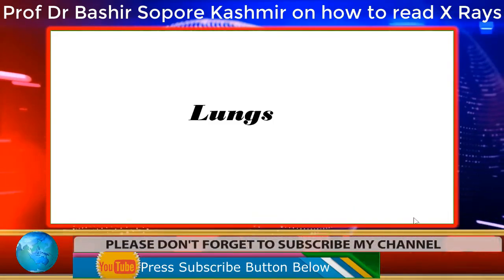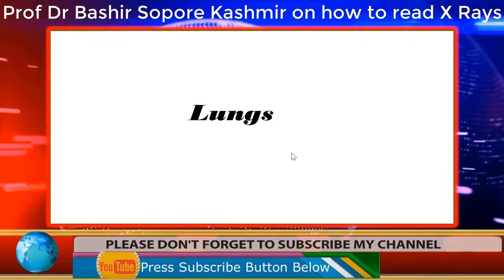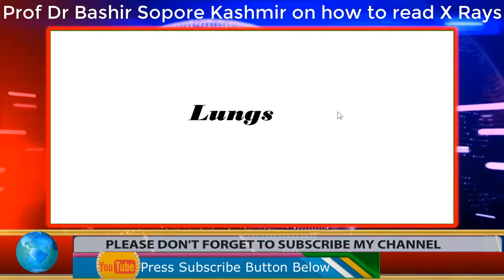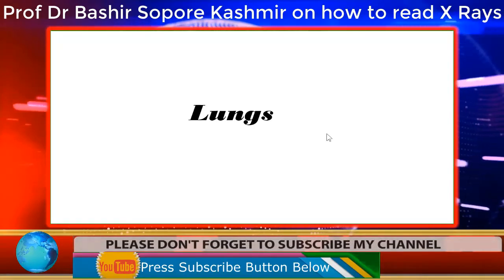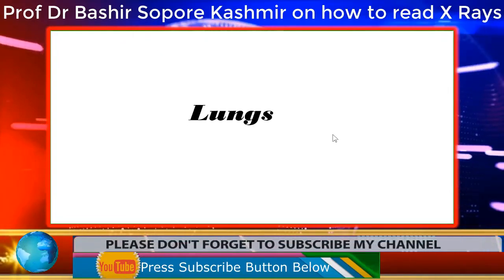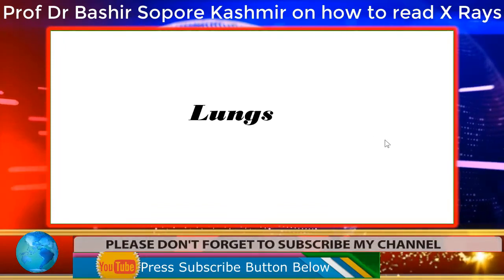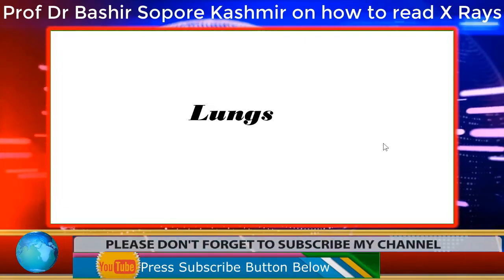Now, last of all, let us talk about the lungs. So in the systematic approach to chest x-rays, we talk of the lungs only last of all. Please note that lungs should be talked about last of all in the systematic approach of reading the x-ray of the chest.